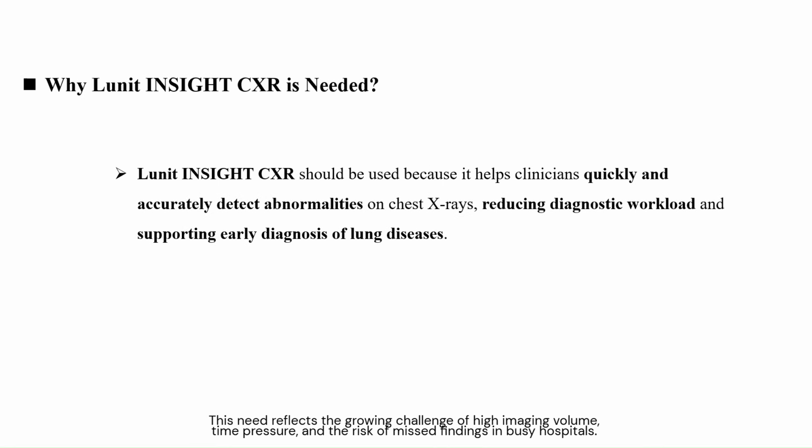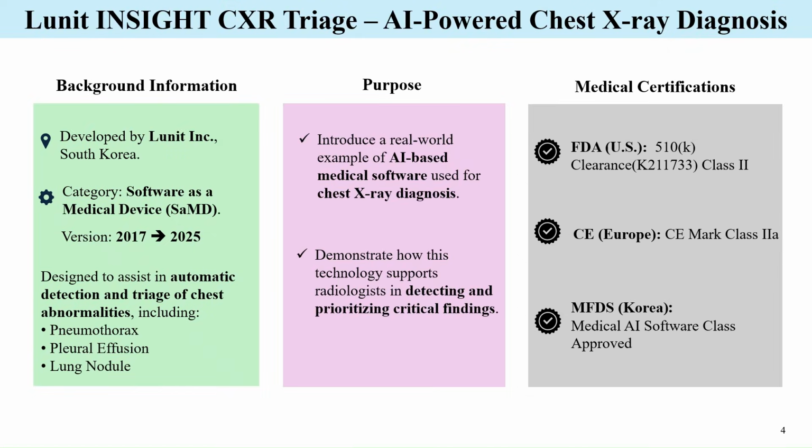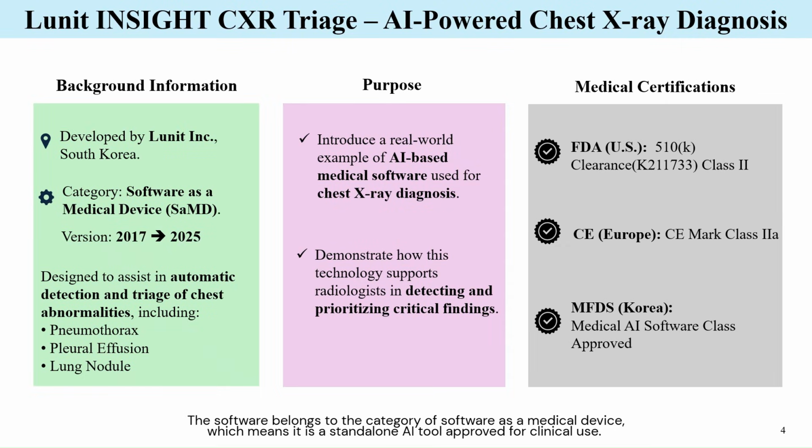This need reflects the growing challenge of high imaging volume, time pressure, and the risk of missed findings in busy hospitals. Coming to the introduction of the Lunit INSIGHT CXR Triage with background information. This is AI-powered software developed by the Lunit company in South Korea. The software belongs to the category of software as a medical device, which means it is a stand-alone AI tool approved for clinical use.